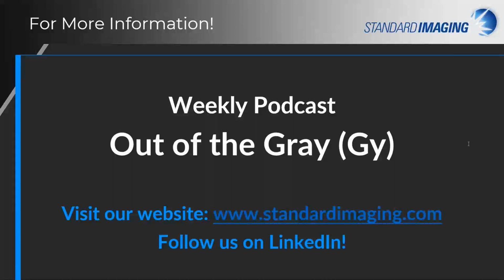So if I missed you, what does this do differently from Radformation's Rad Machine?